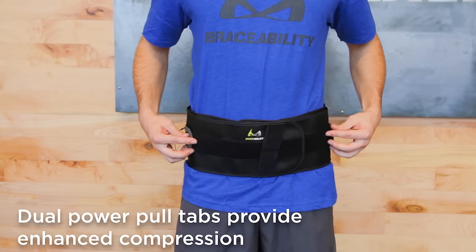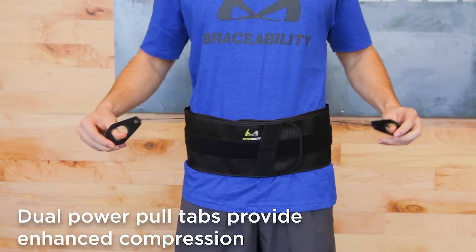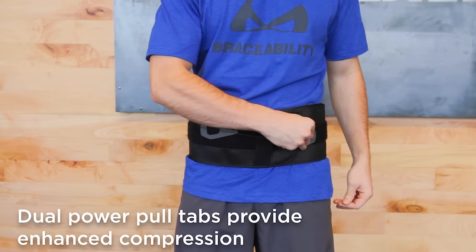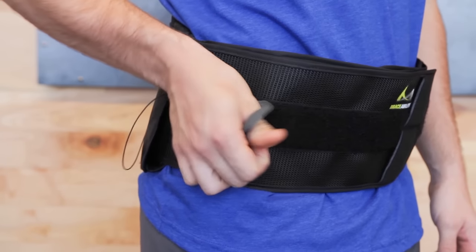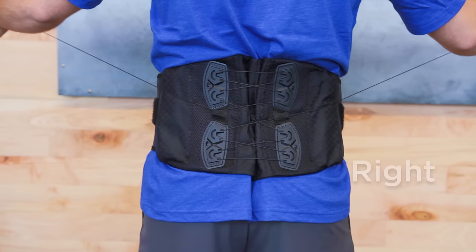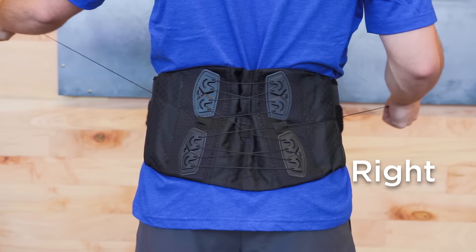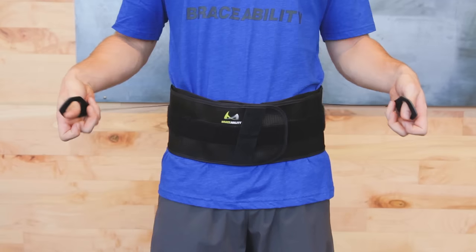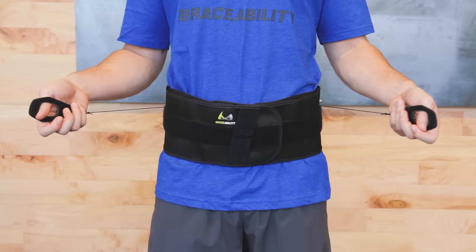Once the brace is on, dual power pull tabs deliver controlled compression with minimal effort. Simply slide your thumbs through the pull tab holes and pull them away from your body. Your right pull tab controls lower compression and your left pull tab controls upper compression. Apply tension until desired support is achieved.